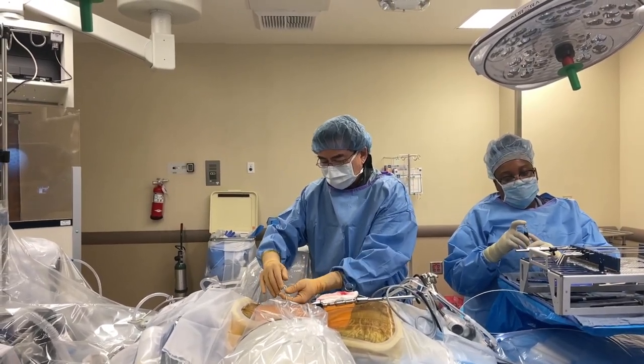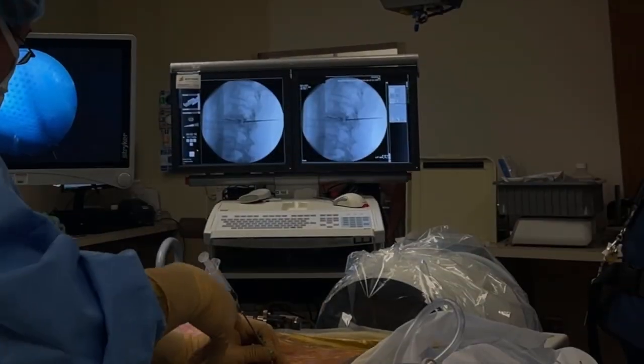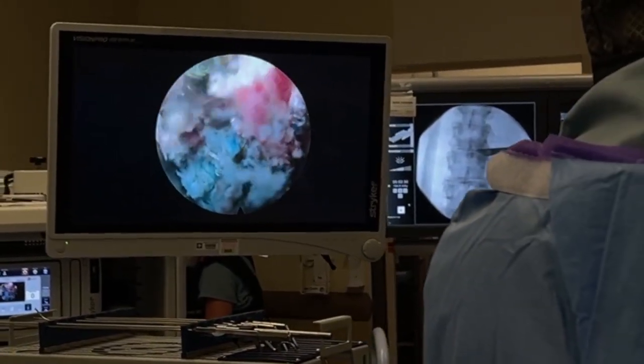Putting the spaghetti noodle dilator down a perfect entry point. It's working, kind of. Oh yeah, look at that leakage. This disc is really disrupted, shot. Okay, I'm at 2-3 now. This is the level that was really inflamed. There's a huge bone spur. The disc is just busted up, look at that.